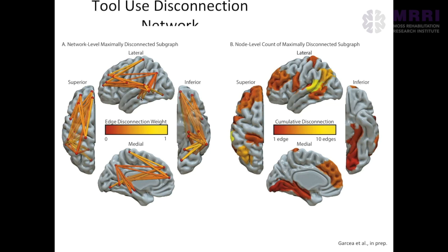You can also include other variables of interest. If you know, for instance, from your voxel lesion symptom mapping analysis that we identify parietal lobe, frontal lobe, et cetera, different regions of interest, you can compute the total amount of damage to those areas for each person and regress that out as well, like you would regress total lesion volume. So it's incredibly flexible.